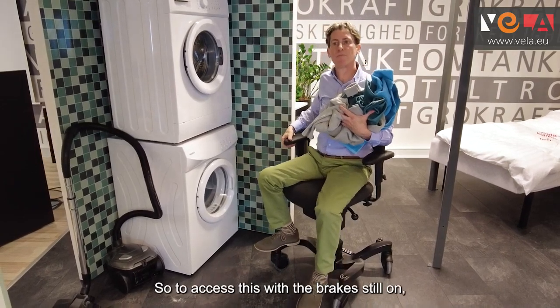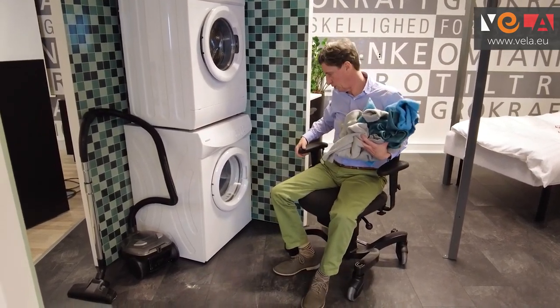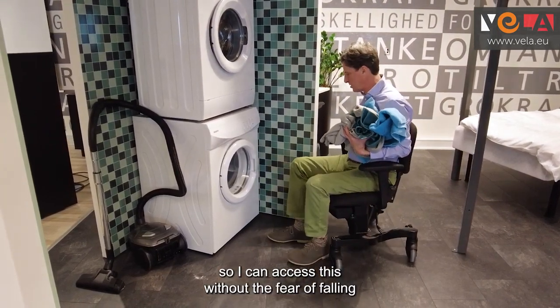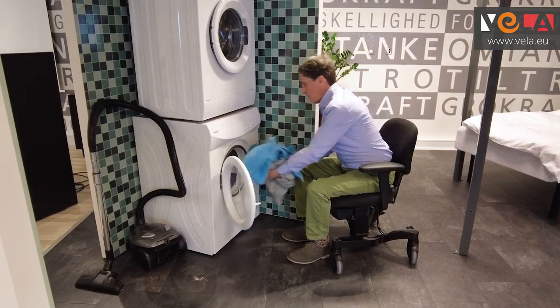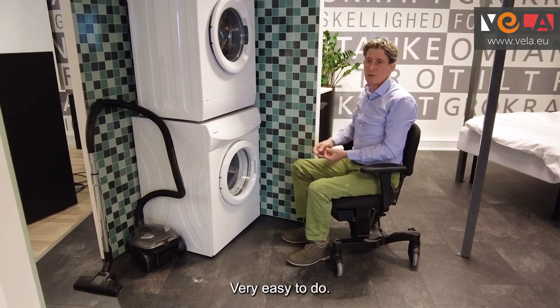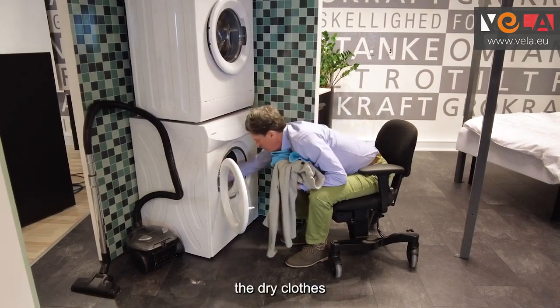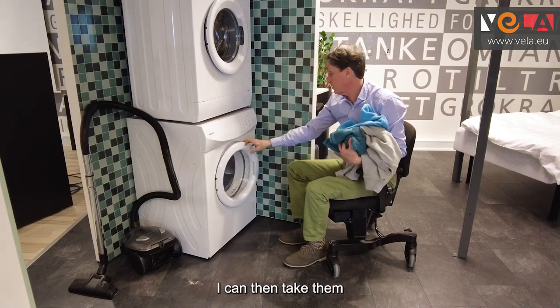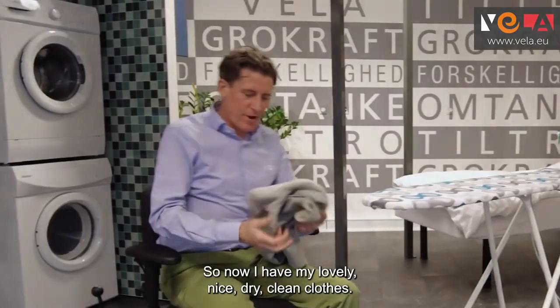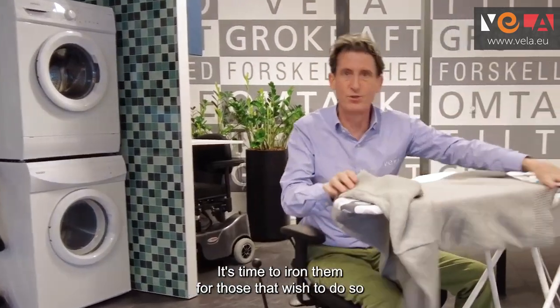To access the tumble dryer, with the brake still on for safety, I bring the chair down to a suitable position so I can access it without the fear of falling or slipping — very easy to do, extremely safe. Once I've removed the dry clothes I can take them through to my next room. Now I have lovely clean dry clothes, it's time to iron them.